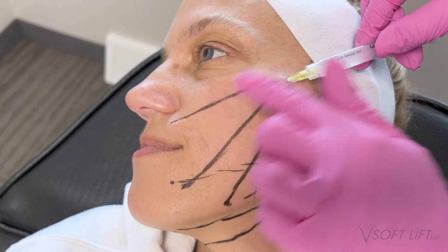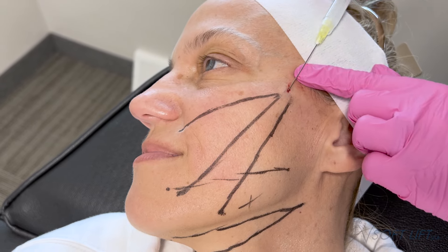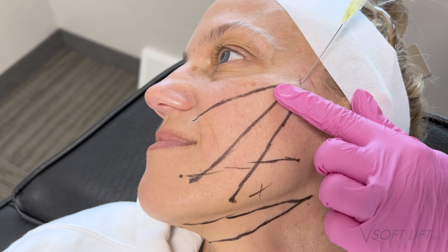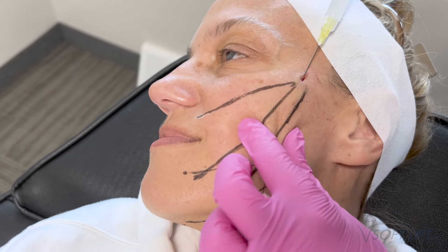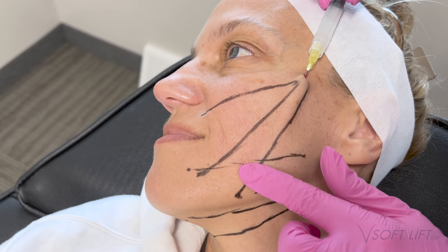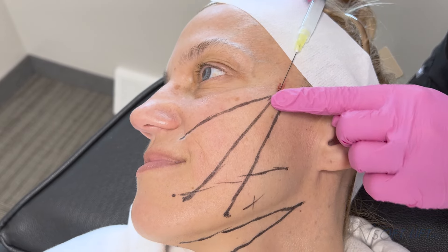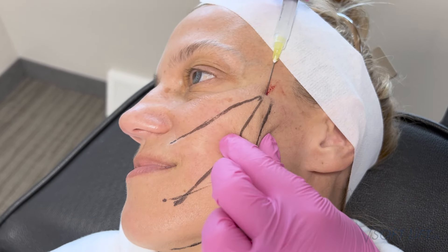Now we're going in with a cannula, placing a little lidocaine. I have my lido buffered with sodium bicarb to take off the burn. I typically do a maximum of 0.5cc in a vector — if the patient is uncomfortable I'll do a little more, but I want to prevent the thread from floating in excess fluid. I just do a little splash to take the edge off and keep the patient comfortable. If you're in the correct plane, the patient really should be very comfortable — as you can see, she's not flinching at all.